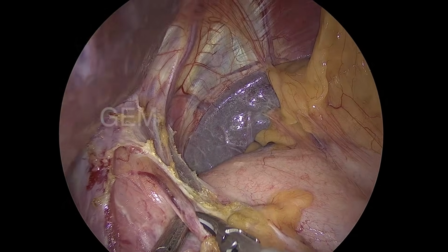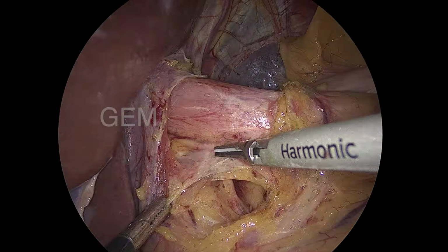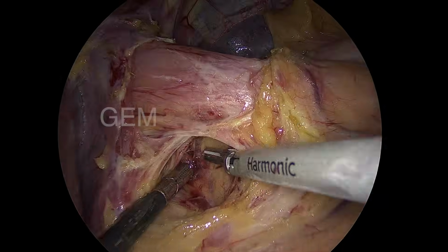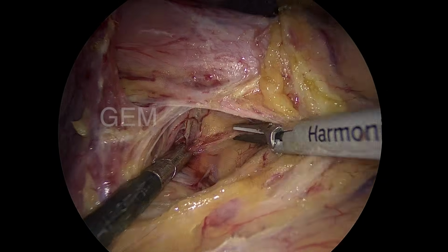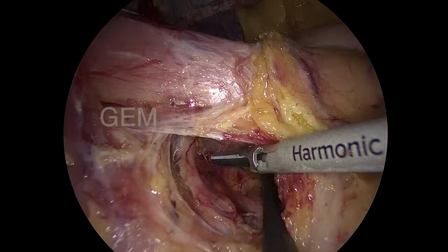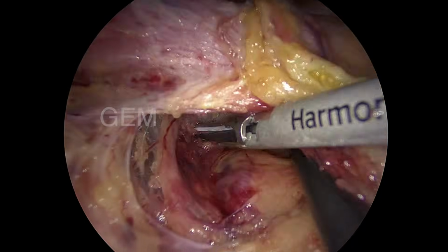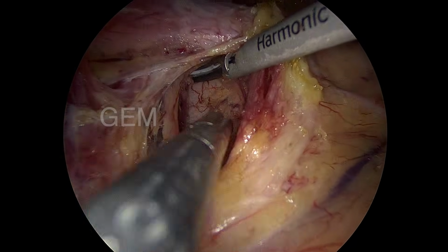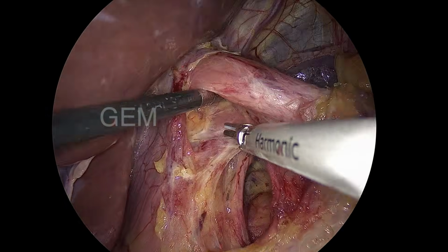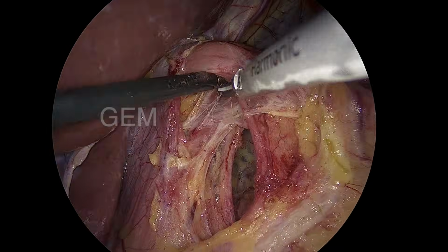So, that is the right vagus now, and sorry, that is the posterior vagus, anterior vagus, this is the posterior vagus, and the inferior phrenic vessel is seen very nicely. So, retroesophageal dissection is completely done. You can see the wide opening. Some more dissection is required, that is the posterior vagus. Along with the esophagus, I lifted the posterior vagus. You can see the crus.